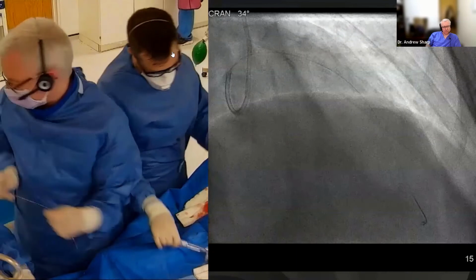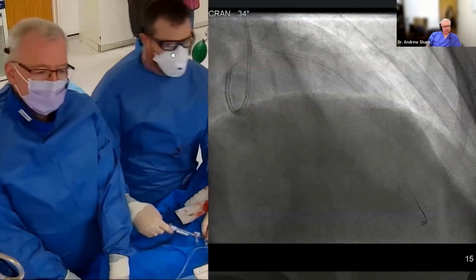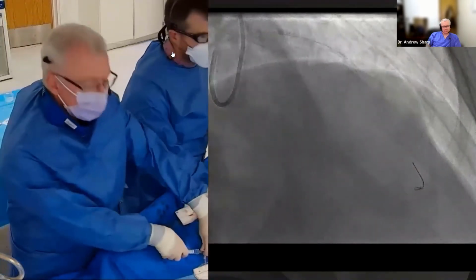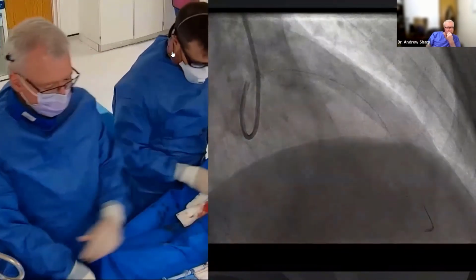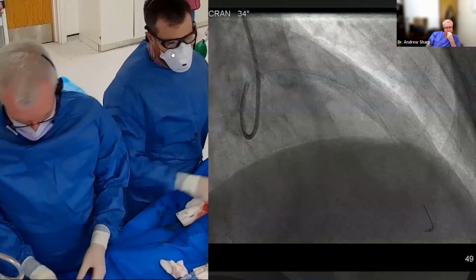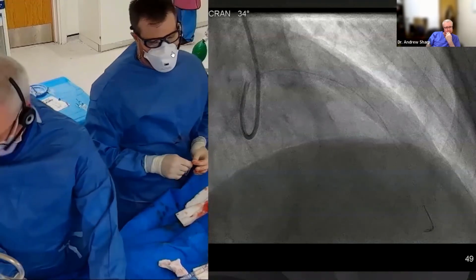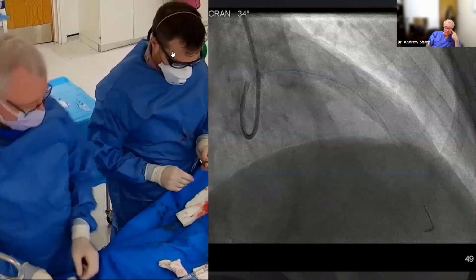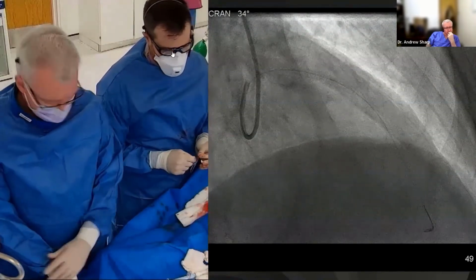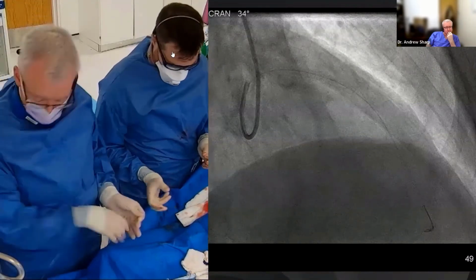Now, the distal reference will accommodate that, so hopefully this will. And we had no choice. We've got to blow it up bigger, because that 5.9 area is not going to be 90% of the distal reference. Okay, that's lovely. Have we got the 375? Okay. It is what it is. Yep. And we want the 375 first. Yep. Okay, great. I'll take that.